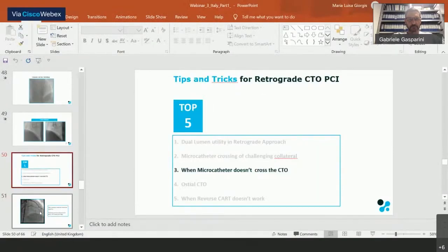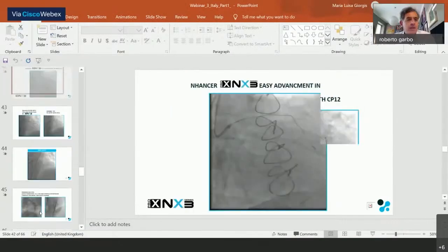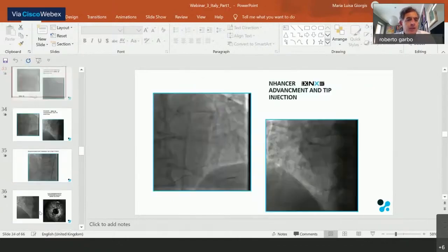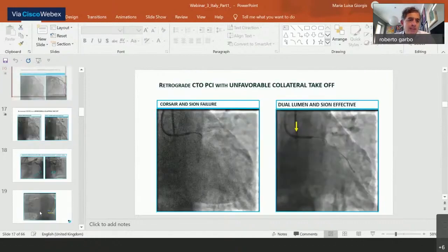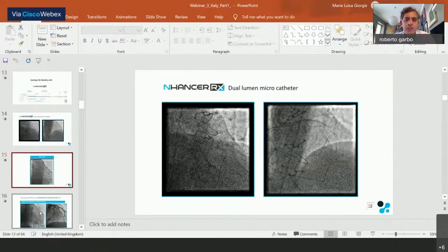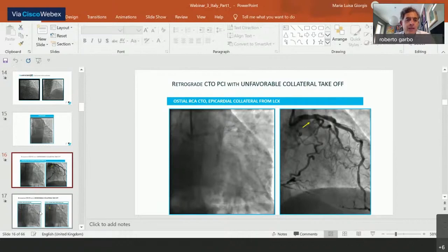Yeah, it was a really interesting case of very classical retrograde with IVUS for evaluation. But I have three comments. The first one is that often we are going to see the failure of recent bypass surgery. So this is a big problem for us, because I think that a failure of the LIMA to LAD after two or three months is not acceptable at this moment. So we need to put a question on that, of course. It's not normal to have a failure like that.